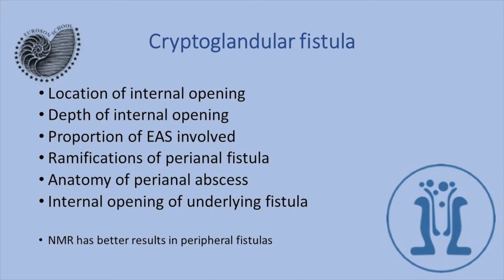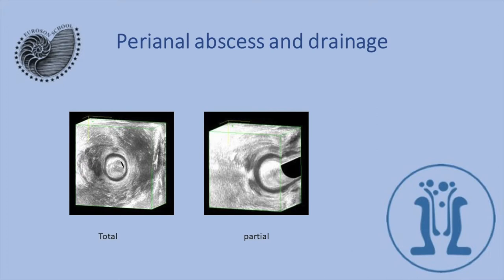Here we see yesterday's patient: this is an anal abscess which was drained in my clinic in an office setting. It was lavaged with hydrogen peroxide, and here we see that the abscess has resolved — here is the hydrogen peroxide inside the abscess cavity. We can see that it has been corrected.